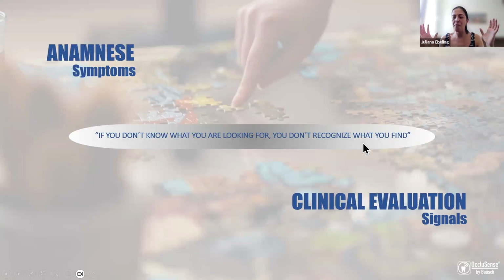You need to have an idea how the system is working to know what you are looking for with the graphic and the information that this dynamic registration is bringing to you. So it's very important to understand if this patient has headaches, muscle pain, cracks, clicks and TMD.